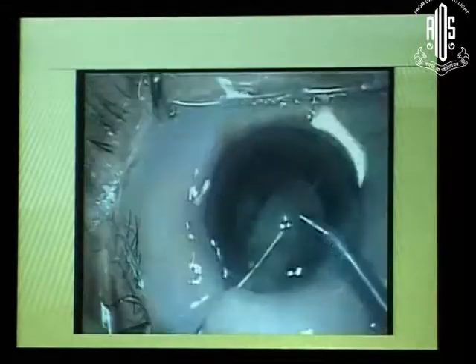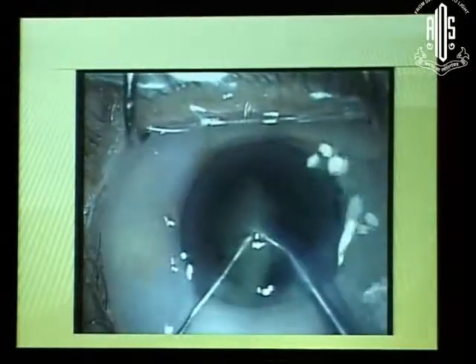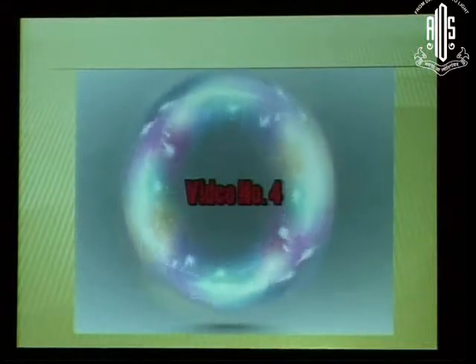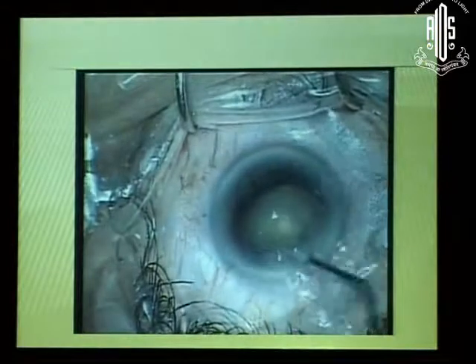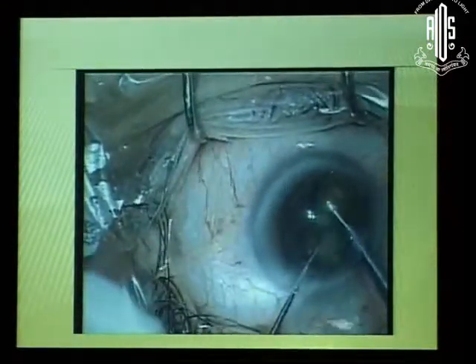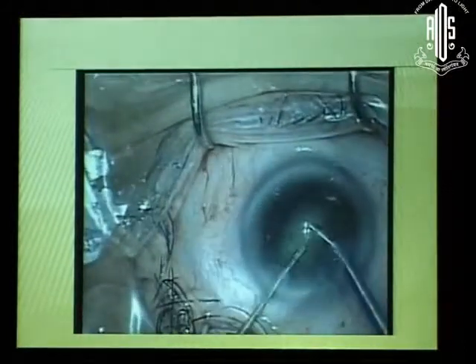And the big advantage of these methods is essentially that you can therefore do your phaco in literally 3 minutes, 4 minutes, walk out, once your lens is fragmented into little bits. And the other big advantage is, remember that a tip generates ultrasound energy. When it is exposed, you bury it inside, there is no ultrasound energy being generated, being spent outside or wasted outside. So these are all protected sources. So the cornea remains crystal clear the next day, which is really what you need to look into.